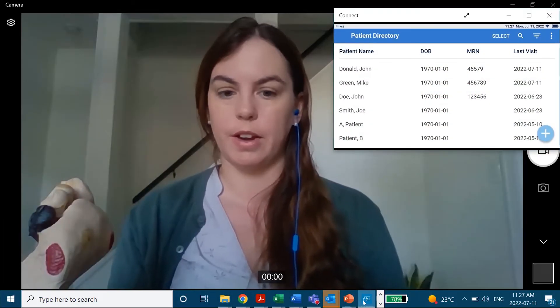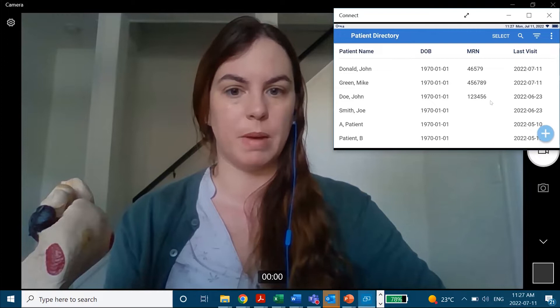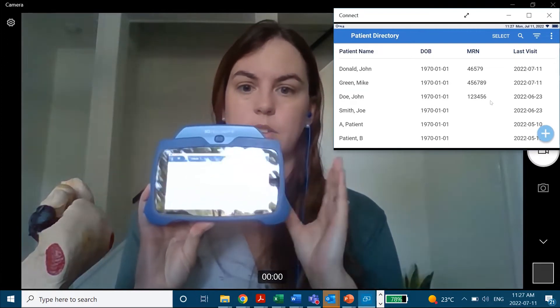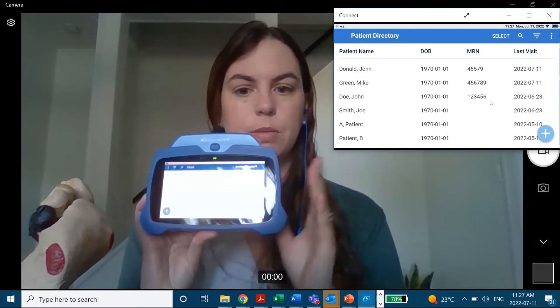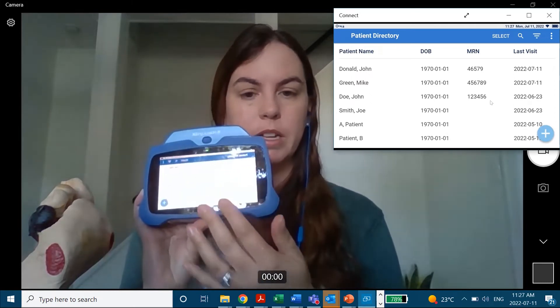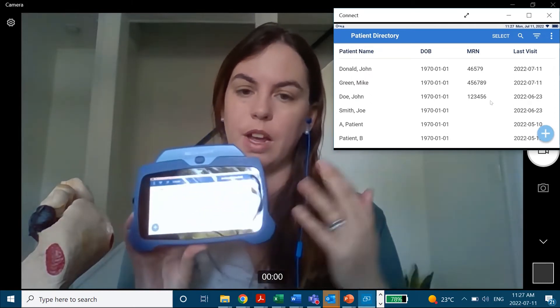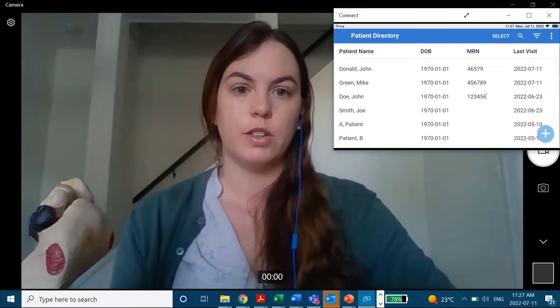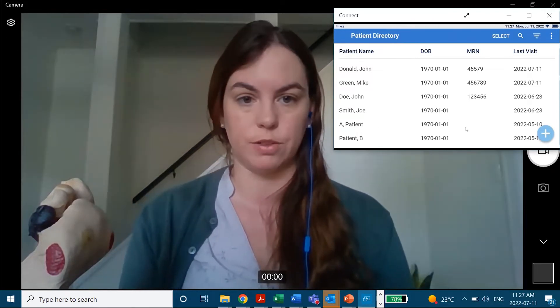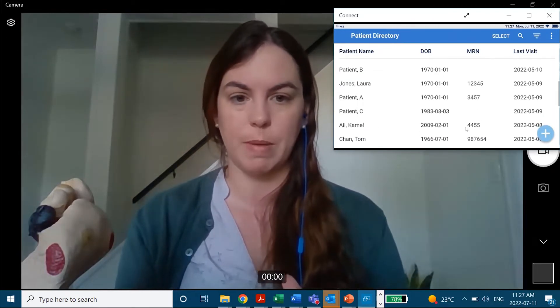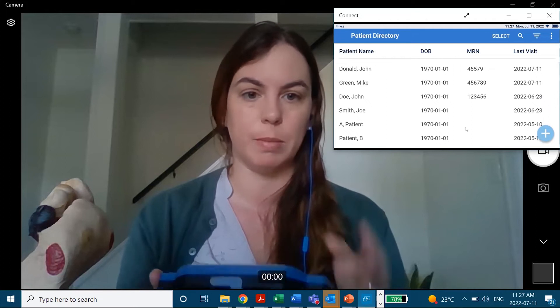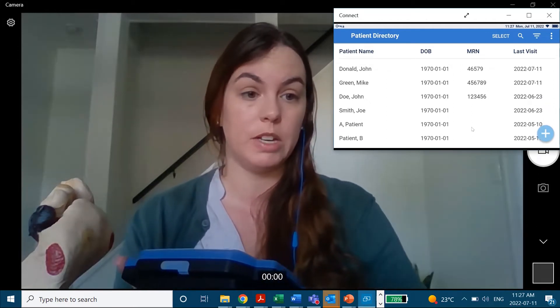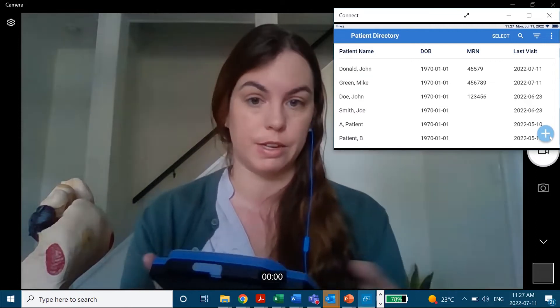What you're seeing here now at the top of the screen is the mirrored screen of the device itself. This is our screen-mirroring capability, which allows me to share what I'm seeing on my screen with my computer and with whoever is on a virtual call. The device has a patient directory, which stores all of my patients and all of their information.